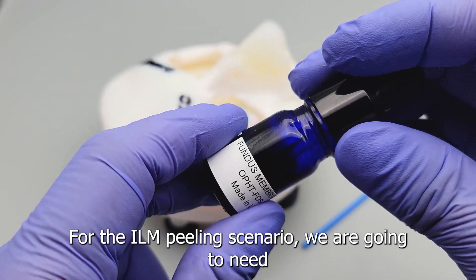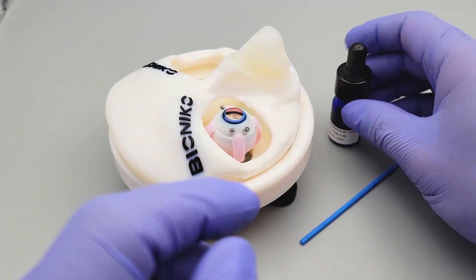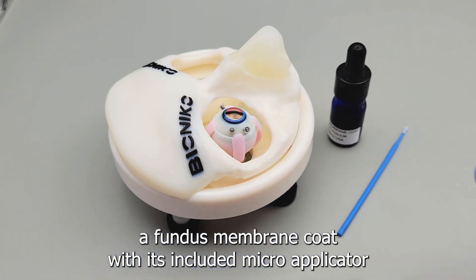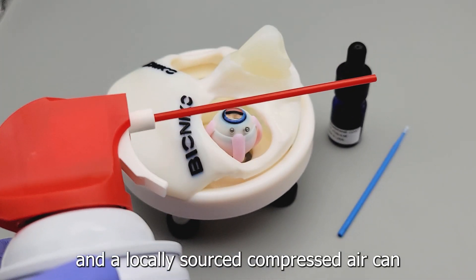For the ILM peeling scenario, we are going to need a fundus membrane coat with its included micro applicator and a locally sourced compressed air can.